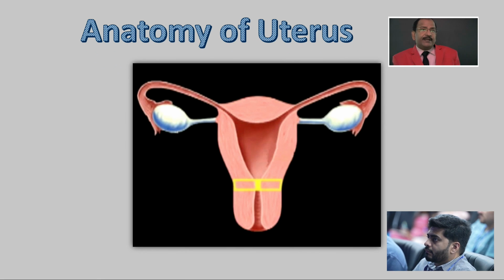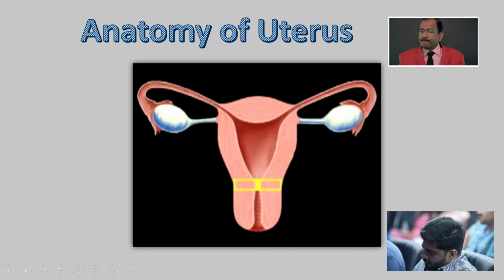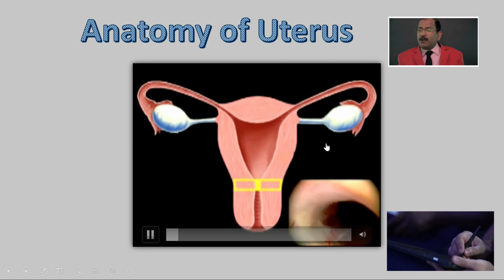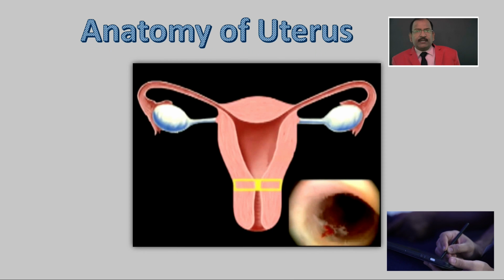But for entry, beginners use 0-degree. Only drawback, you have to buy one extra telescope, but it will make your life easy and entry better. So, this is 0-degree telescope, and what are the 3 important things to learn about a telescope? One is diameter, second is optical axis, and third is number of rod lenses. Am I right?